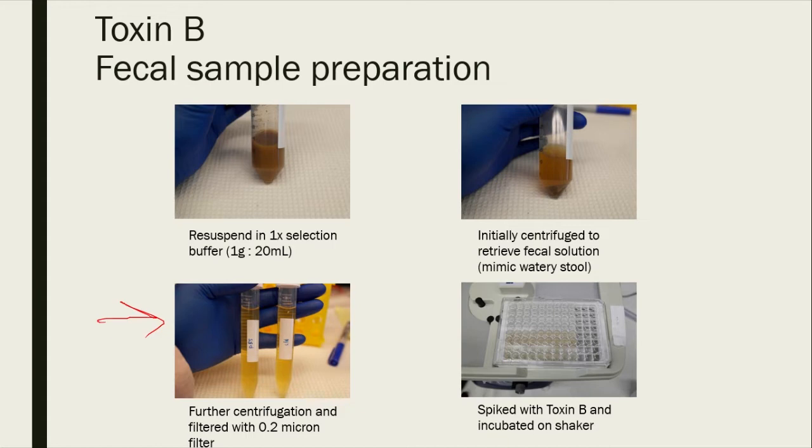So this is just an example showing you how people can use these fecal samples to detect toxin B. Remember what that is? It's from C. diff. You can detect those C. diff toxins in the hopes of facilitating diagnosis of Clostridium difficile. So that is just one example.